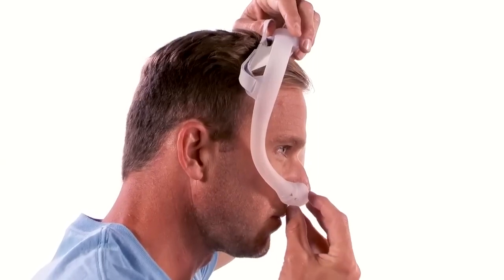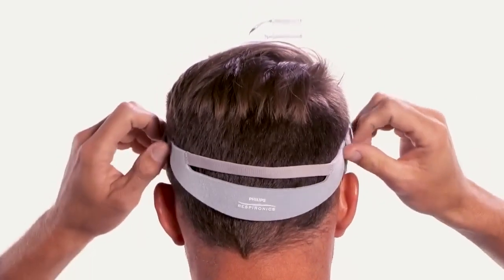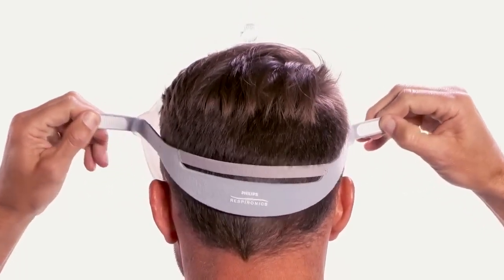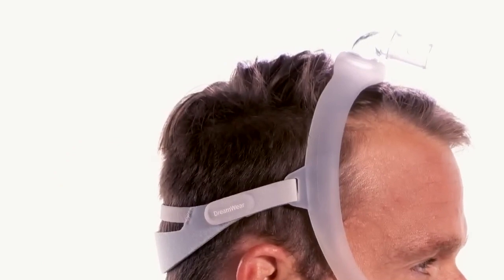To put the mask on, hold the cushion in place beneath your nostrils and position the frame on the top of your head. Pull the headgear down until it sits across the back of your head. Peel the headgear tabs away from the fabric and adjust the length of the straps evenly to achieve a loose, comfortable fit. Press the tabs back against the fabric to reattach. Be careful not to over-tighten, which may make skin bulge around the edges of the mask and cause redness or abrasions.